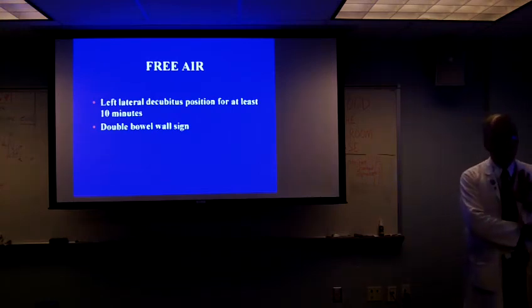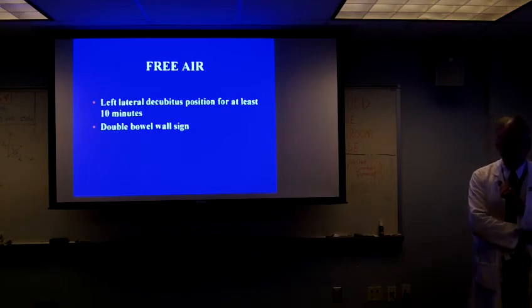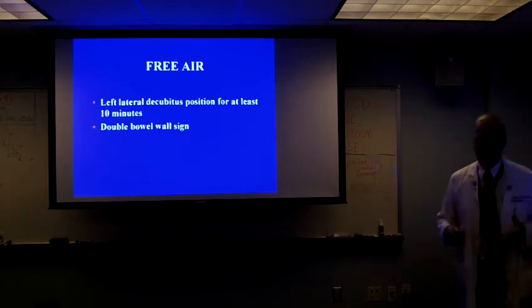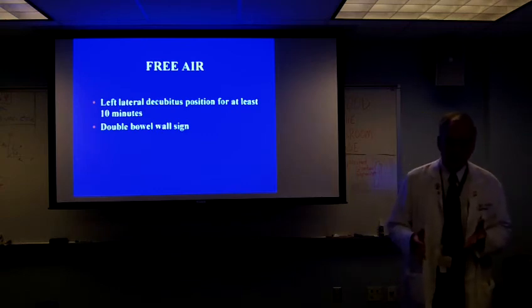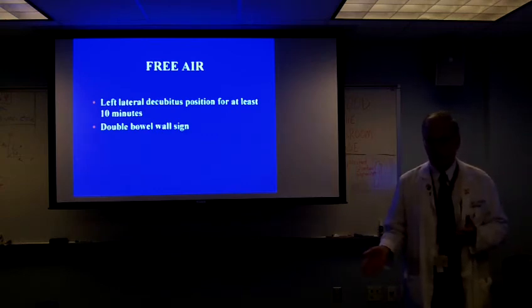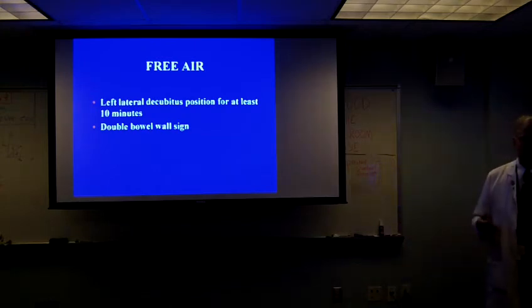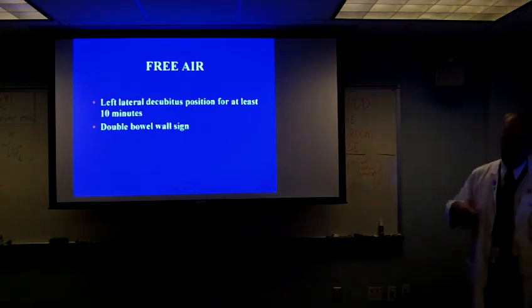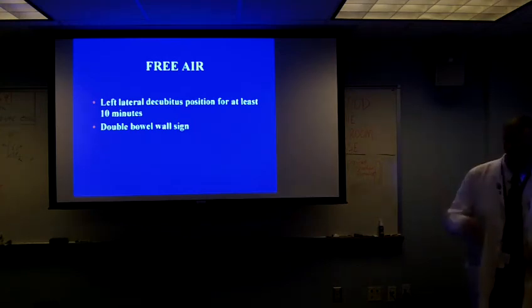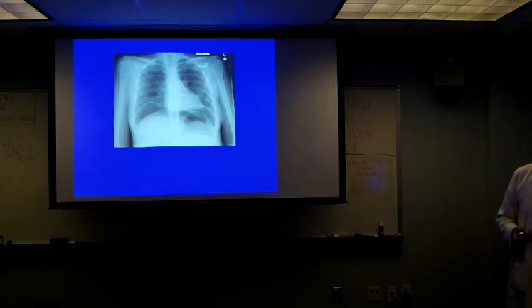Ideally, in the best of all possible worlds, if a clinician has a patient that they're worried about an abdominal process and they want to exclude free air, they would have the nursing staff put that patient into the left lateral decubitus position while they're calling down the order for the abdominal film. So by the time the technologist gets up there to do the films, the patient's been in the decubitus position for 10 minutes. Any free air has had a chance to percolate up over the liver margin. I don't think that happens all the time.